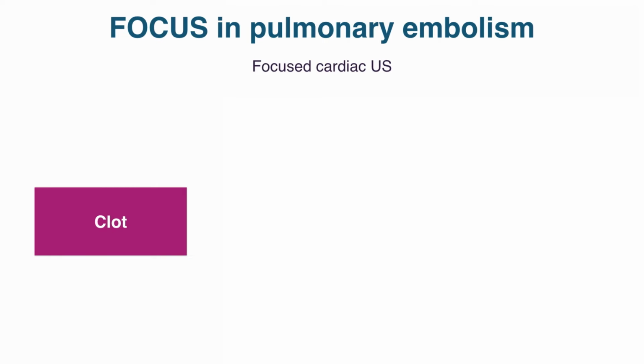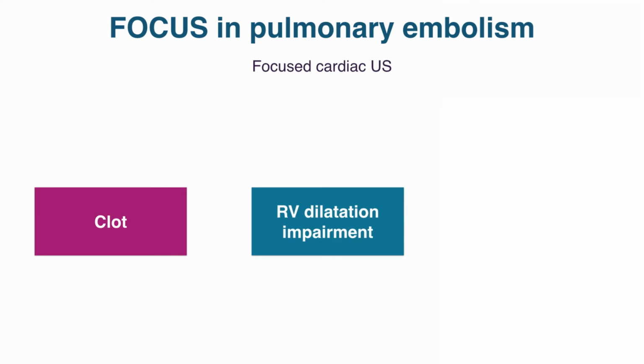There are some indirect signs like dilated right ventricle, impaired right ventricle free wall function with or without intact apical function. And naturally, the D-shaped sign, that is a systolic septal flattening. Yes, Bruno, we talked about this in chapter number 14, where we will deal with right heart disease.